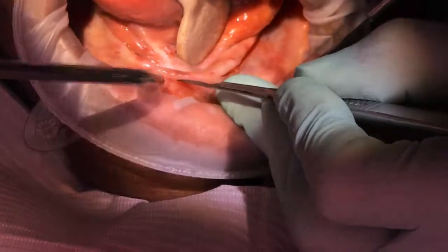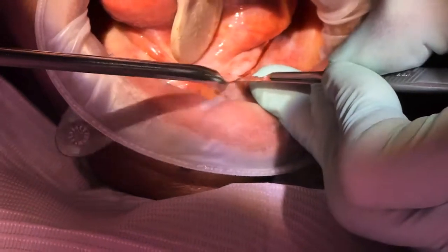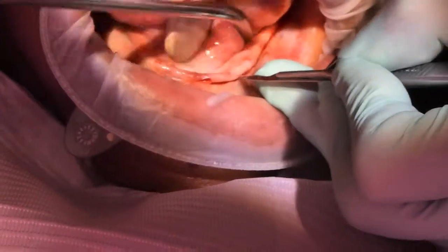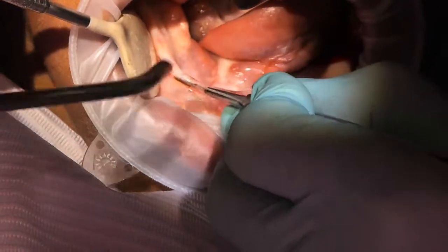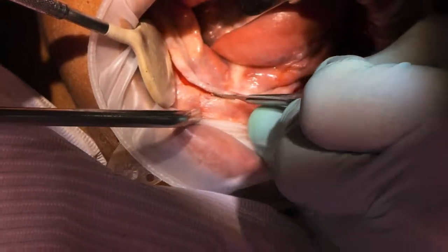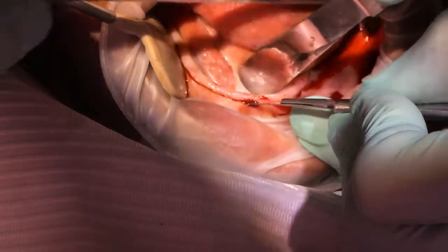Okay, now on to the mandibular. The mandibular pin guide fits against the maxillary pin guide, but it also fits against the new maxillary prosthetic. This way, we can ensure that there's a perfect seating of the pin guide. Now, if you'll recall, the labial sites were already drilled at the very beginning of the procedure.